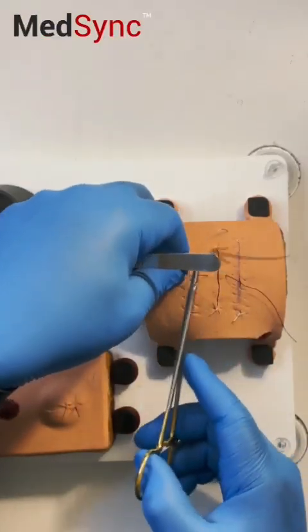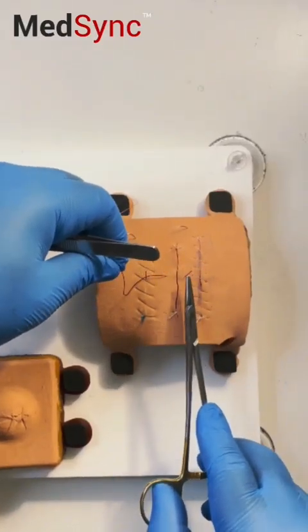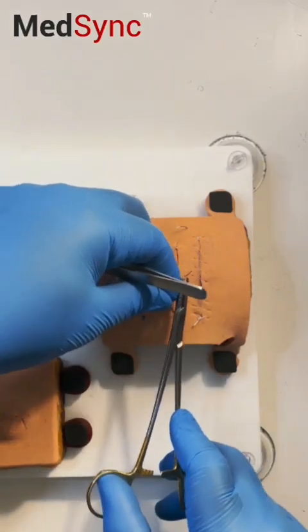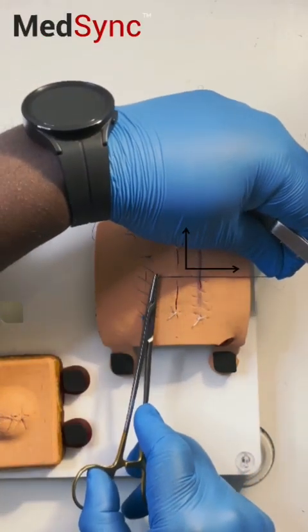Pull through with just one hand for economy of movement and real speed. Leave a short end and a long end, then wrap the suture around the tips of the needle holder. Lay the suture knot perpendicular or at 90 degrees to the wound itself.